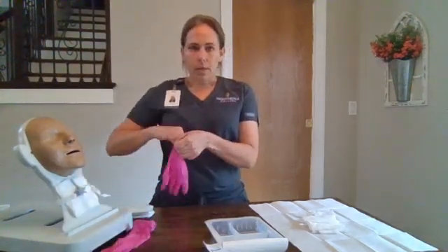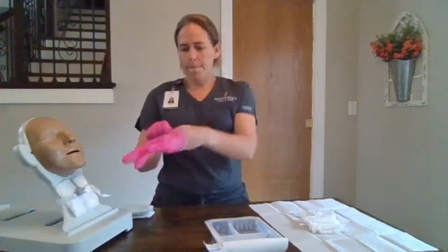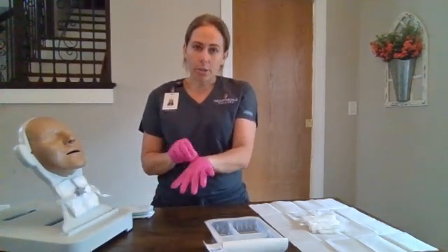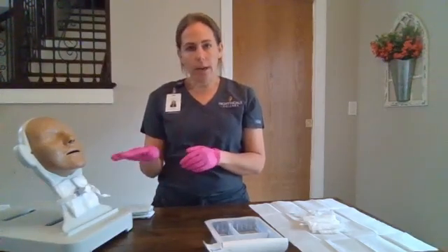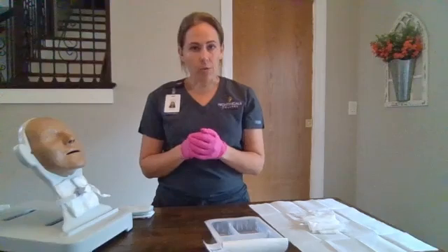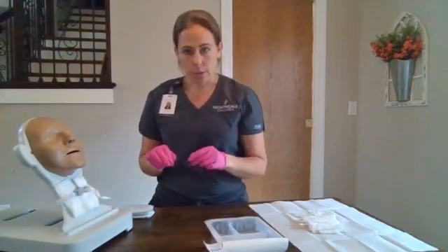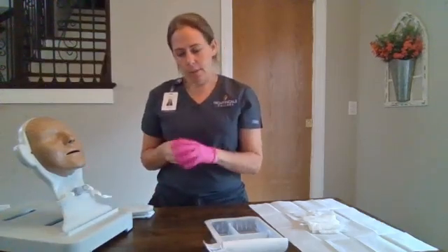We're going to put our gloves on. Ideally, I would ask another nurse or nursing assistant to come help with this procedure, and have them stabilize the trach so that it doesn't fall out or dislodge. We're going to remove our inner cannula, unlock it and remove it, and place it in our soaking solution. We're going to remove our soiled dressing and discard that with our gloves.